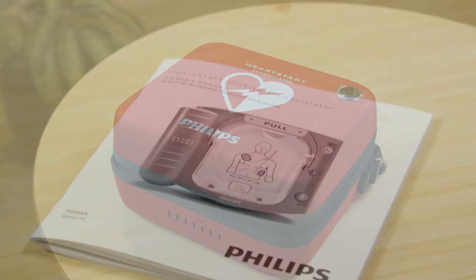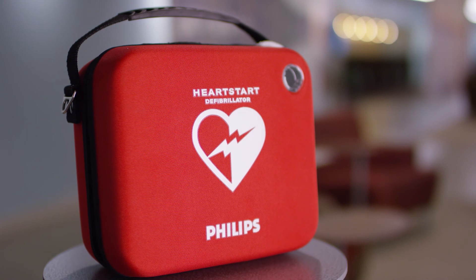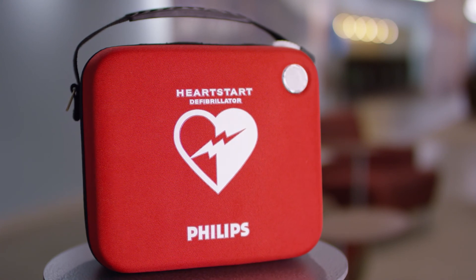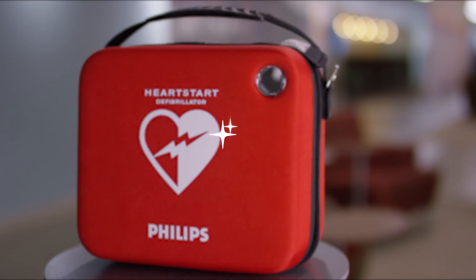For more information about maintenance and cleaning, check your HeartStart OnSite Owner's Manual. Follow these few steps and you will ensure your HeartStart is ready to help save a life when you need it.